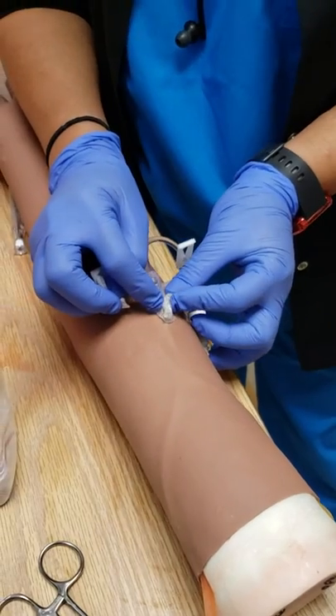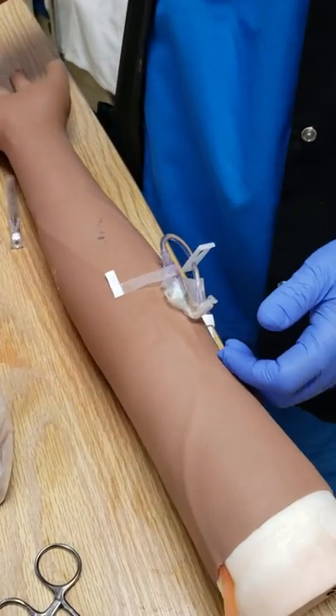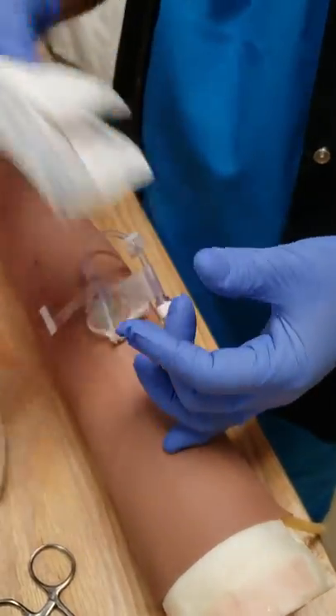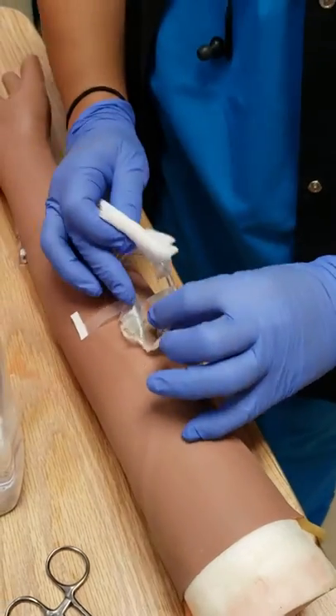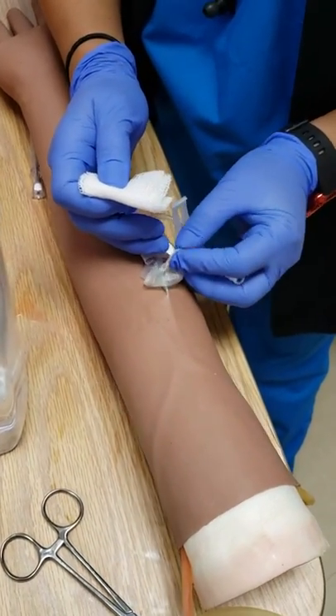Alright, so you've removed the tape all around. Now I'm going to take the gauze, fold it, and make sure that the tape is fully removed. Then pull back.